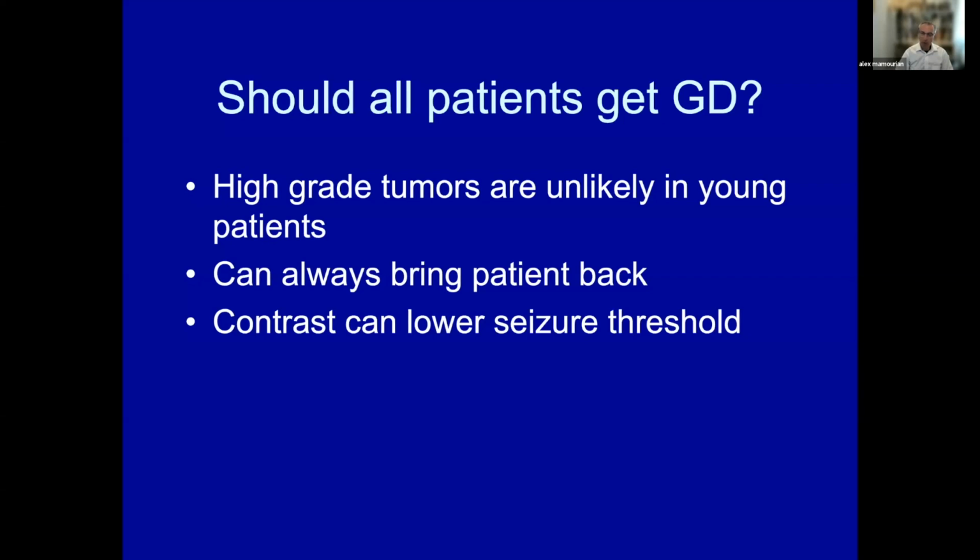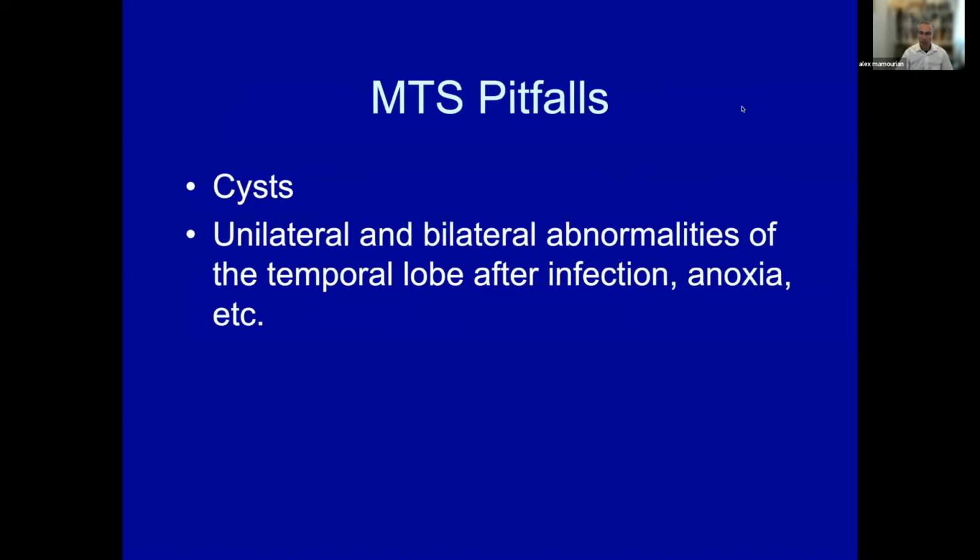So again, I don't recommend contrast as a routine in young patients. Now again, it's different in older patients that come in with, let's say, someone my age with new onset seizures, yeah, of course, you're looking for a brain tumor in your differential, and by all means, give contrast.